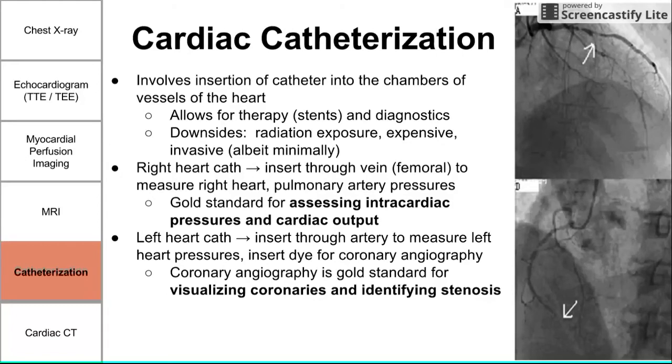And if you look carefully at these images on the right here, we see the white arrows pointing to areas of stenosis in the coronary arteries, to areas that show the dye is kind of cut off, is kind of blank for a moment, indicating that there's not much blood, there's not much fluid passing through the arteries at the point that the arrow is indicating.